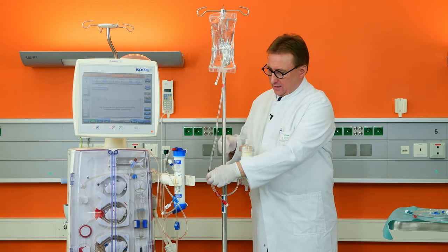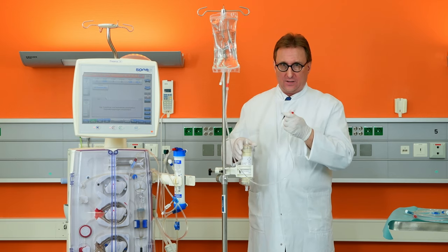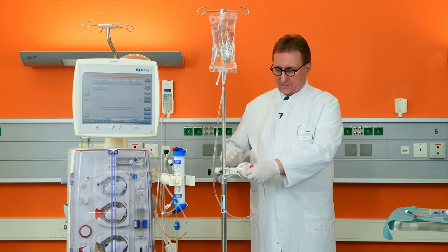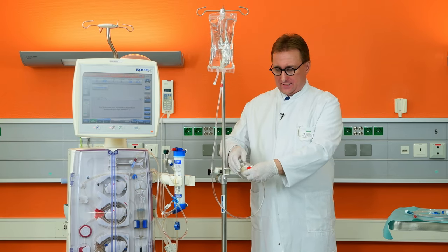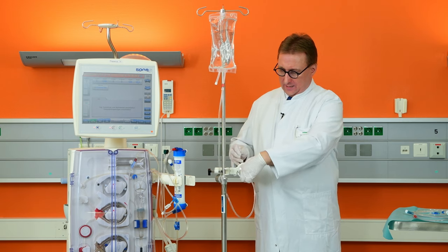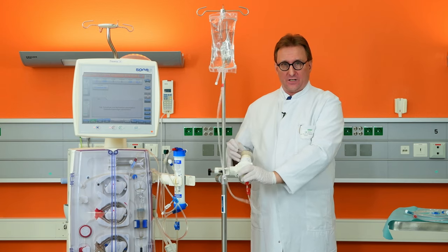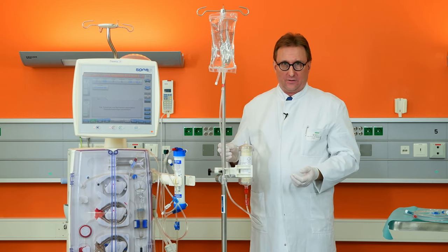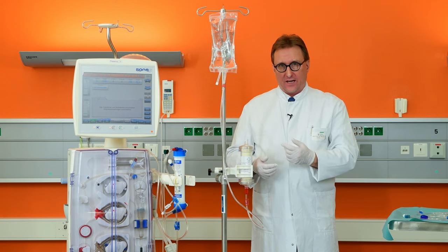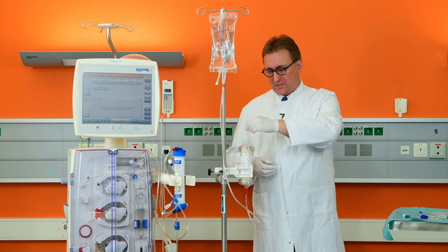Then take a saline tubing and connect it to the arterial port of the Seraph, tilting the Seraph by 90 degrees and then tilting it back to its original position. The venous port of the Seraph is then connected to a discard bag using no-touch technique.